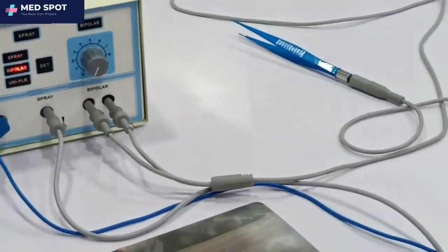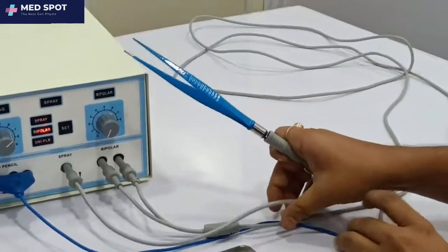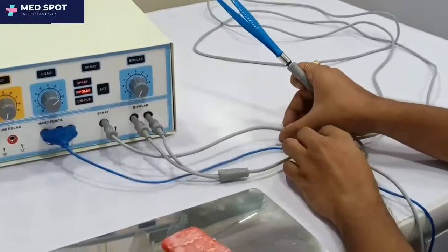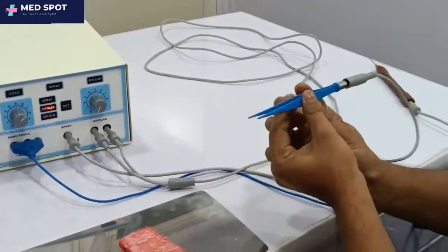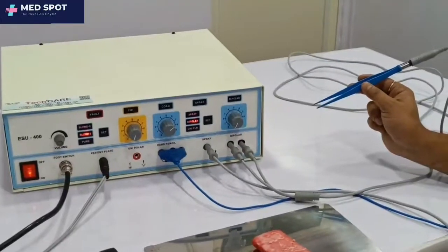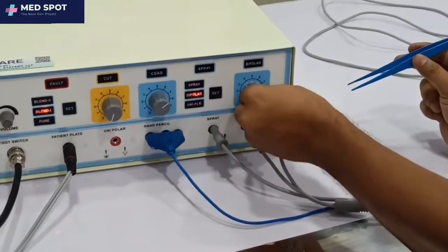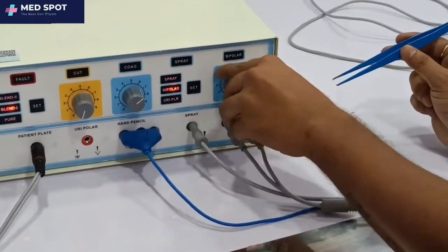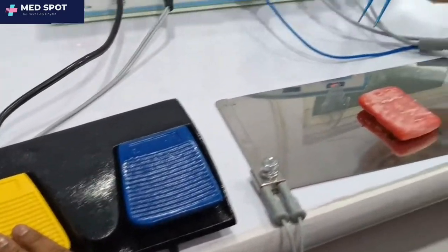Now we will test the bipolar accessory. This is the bipolar accessory. The machine is now in bipolar mode. We just need to increase the intensity for bipolar — press this button. The bipolar is now activated and running.